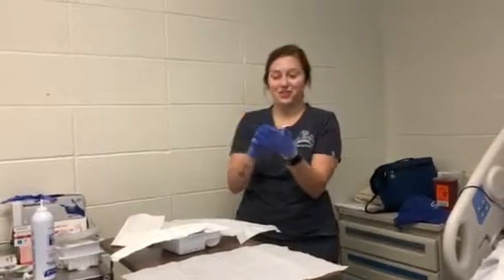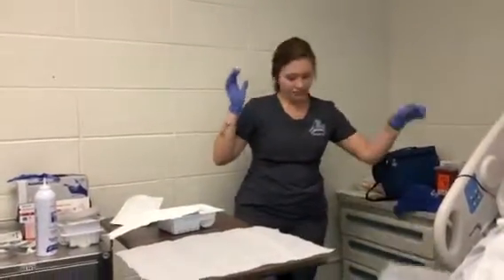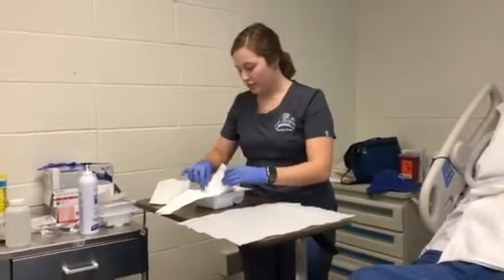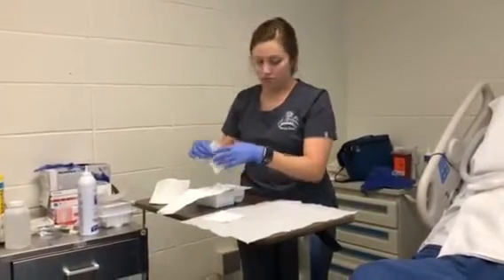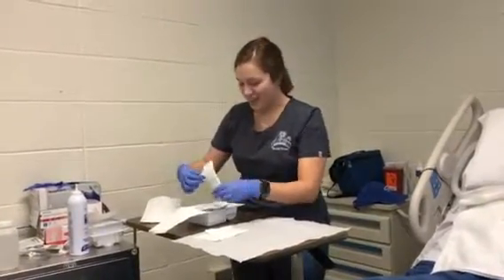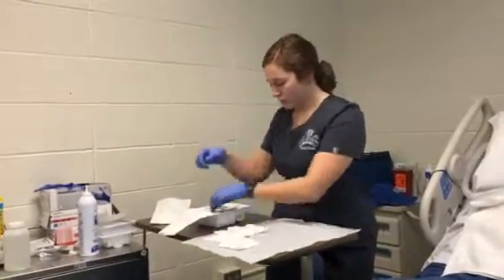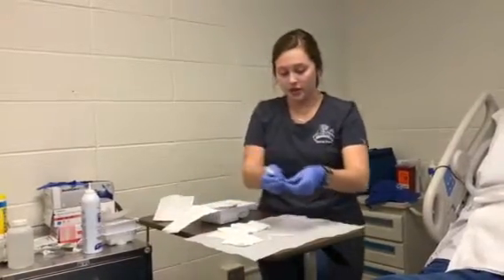Okay, then once you have those on, you can fix them. And again, we'll get rid of this. And now everything in our sterile kit we can take out and lay on this pad. And that way we get our kit cleaned out. And we are ready to pour everything in here.